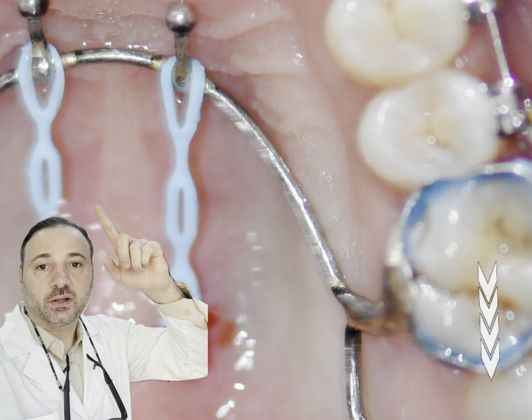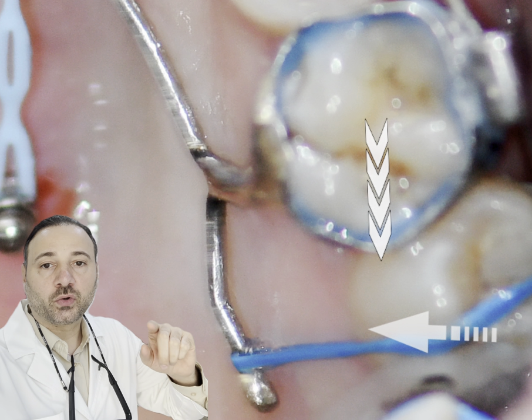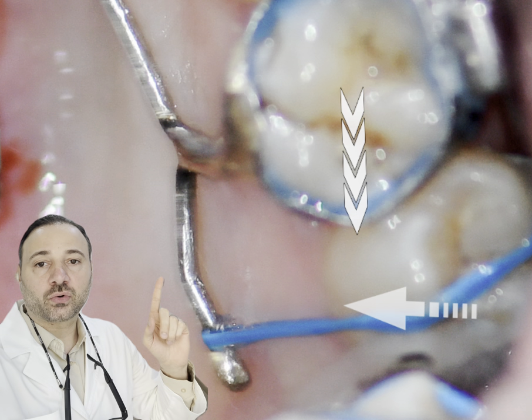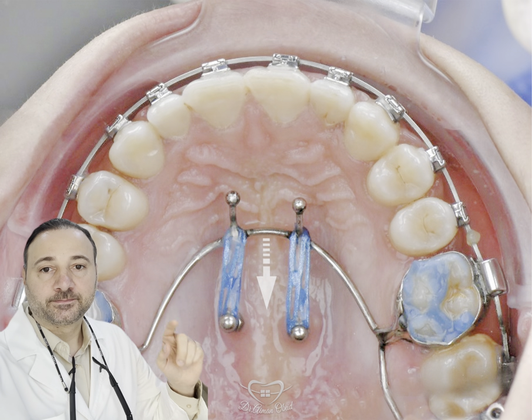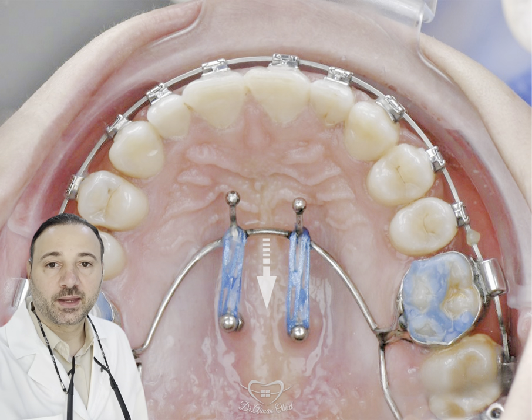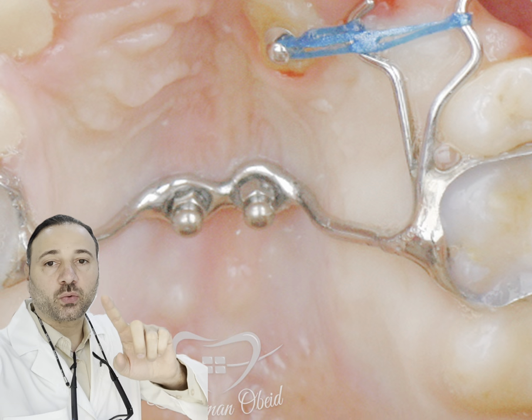Using this C-type arch with extended arms to correct the scissor bite on the posterior area. In this photo, I have used the two palatal TADs connected with the TPA.